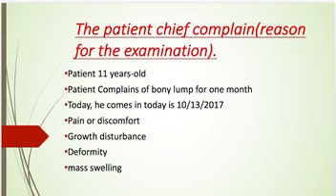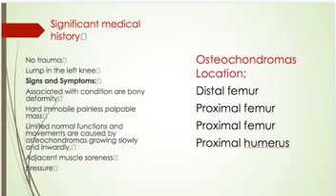For the significant medical history, no trauma. He feels a mass or lump in the left knee. His doctor ordered a left AP knee and lateral knee, only 2 views. As per our site protocols, we do it standing.